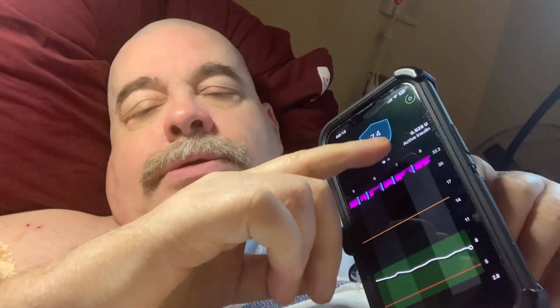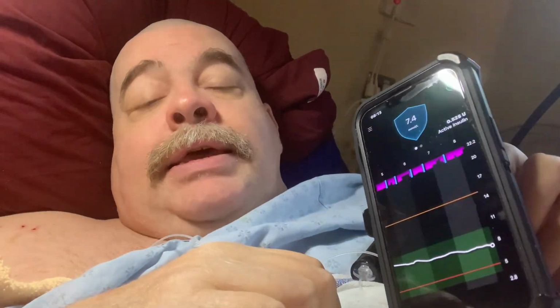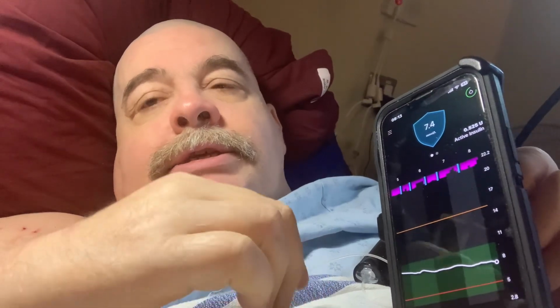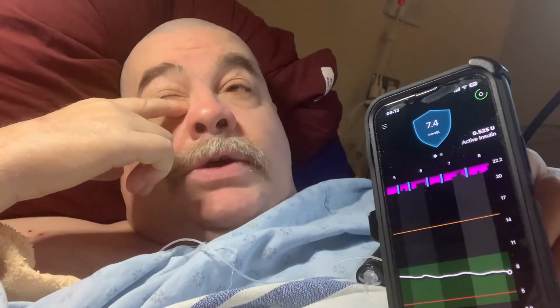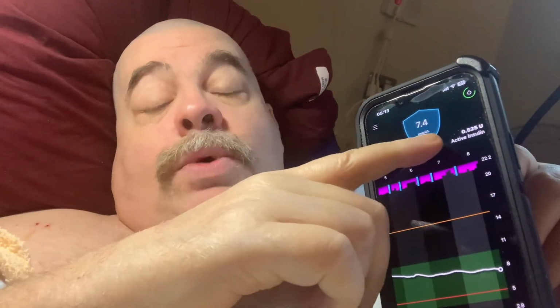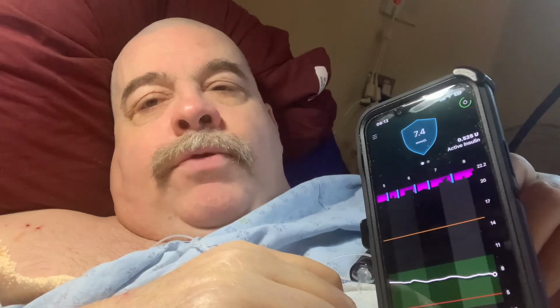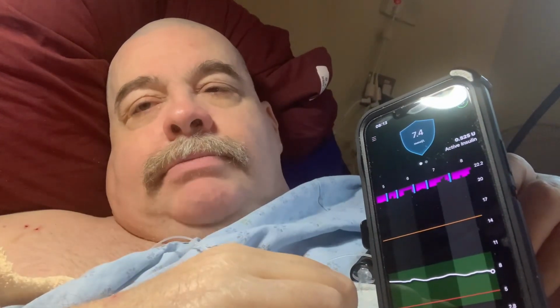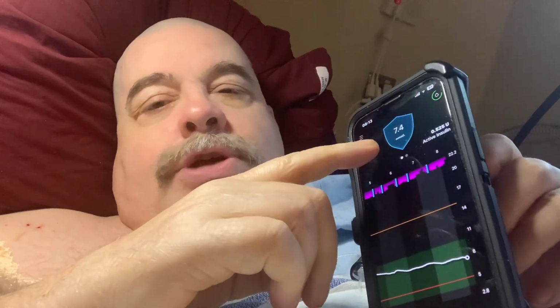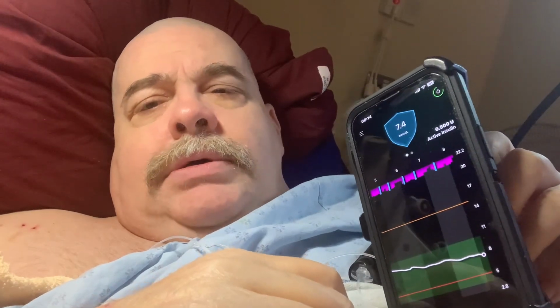It also, something I forgot, gives you the active insulin. That's the amount of insulin that you have taken into your body and is still working. What's here, if you type in carbs for a meal, that will be subtracted. Now that will change, for me, I believe it's every 2 hours.